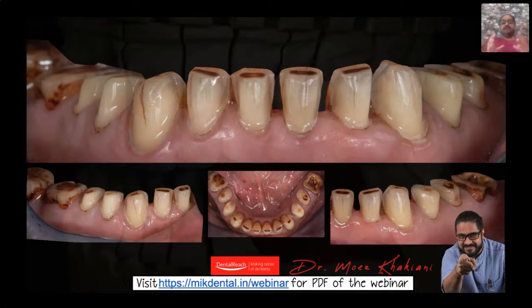The endodontically treated access opening is normally what we fill with composite. Here, I have not filled it up at all. I have left it completely open and gone ahead and registered my impression. So now the final prosthesis that comes in has an occlusal veneer and a small umbrella-like extension in porcelain. And I go ahead and bond that directly onto the tooth structure. Endo crowns work brilliantly for posterior molars which are endodontically treated. Please don't do these for premolars, do them for molars. They work fantastically well. Right?